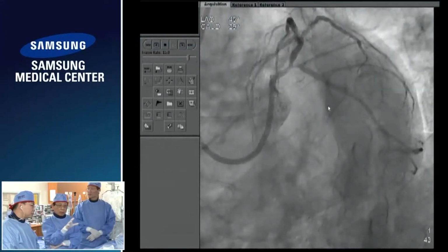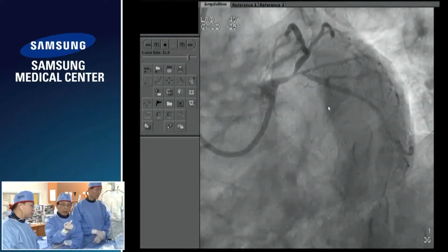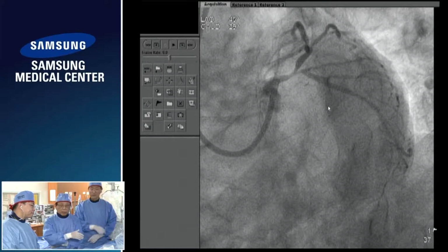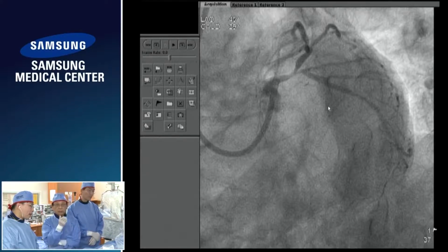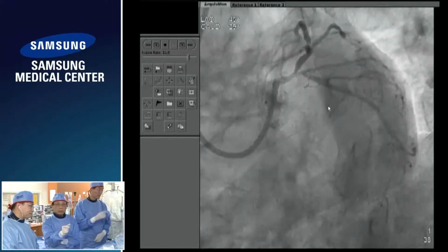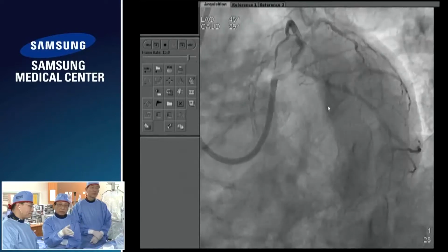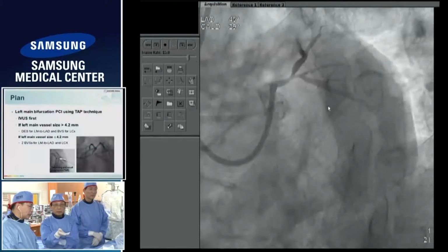So one stent extending from the proximal LAD up to cover the ostium, and the other one is BVS across the DES to the circ. So, of course, you may argue that this is a very simple bifurcation. Of course, this is a true bifurcation stenosis, but the disease extends less than 5 millimeter from the circ ostium. There are currently several ongoing studies, among others the EBC MAIN, just to know whether in this kind of situation, two-stent strategy is better than one-stent strategy or provisional stenting strategy.